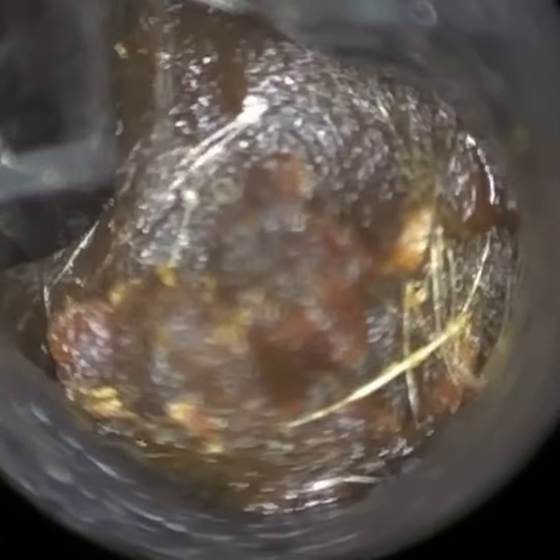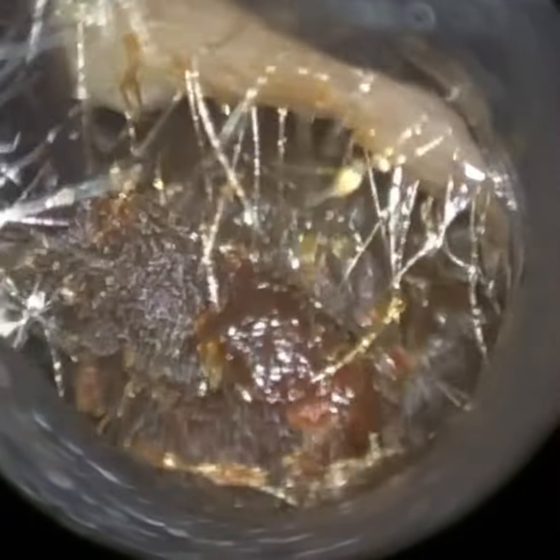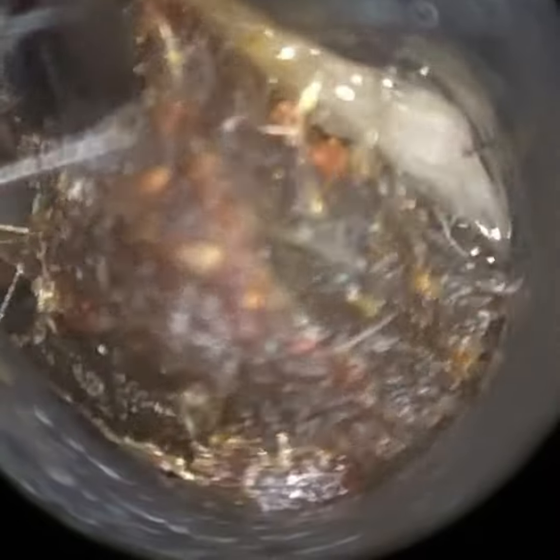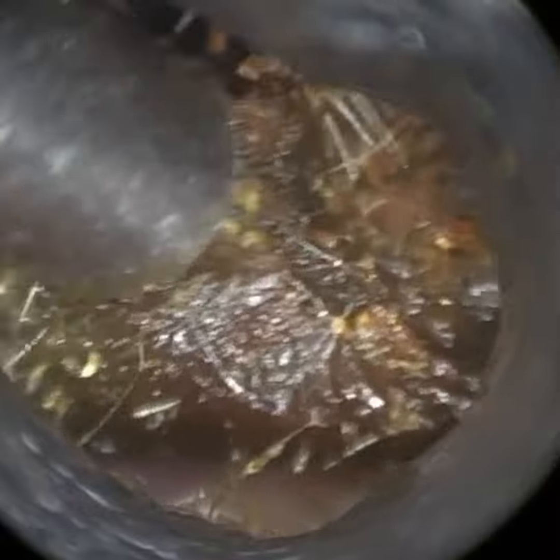I'm going to adjust the focus and go with the hook. You can just see the crystal clear view it provides with the hook. I managed to get some out. The wax here is probably a bit softer, so although the hook is bringing some wax out, it's also cutting through it. So I'm going back in with the suction probe to bring out some of the smaller pieces. Sometimes I use the ear hook not to necessarily remove the wax in one solid piece, but to chisel through hard wax or slice up softer wax and then go back with suction. You're using the tools in combination, and that's key.